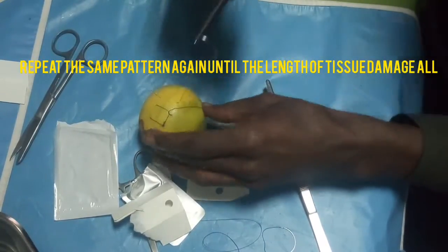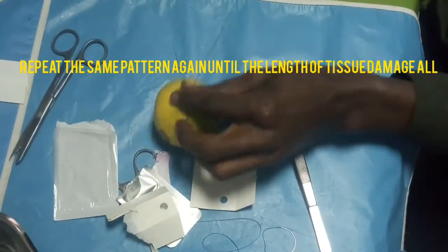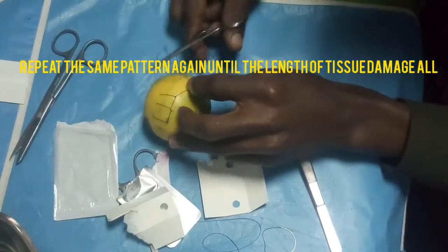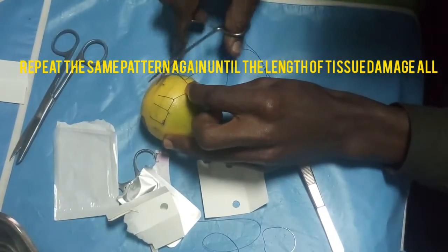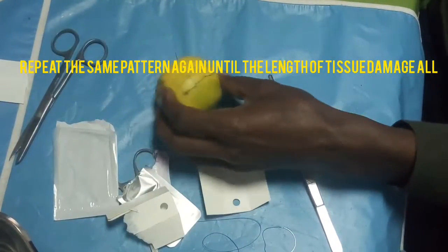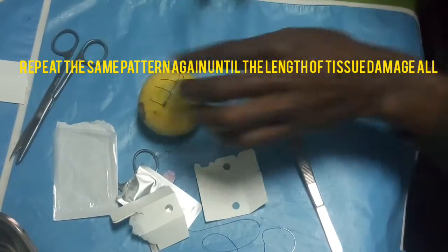on the back side, and now you see you have moved to the interlocking pattern. Take your needle again, make this pattern, interlock, come again.